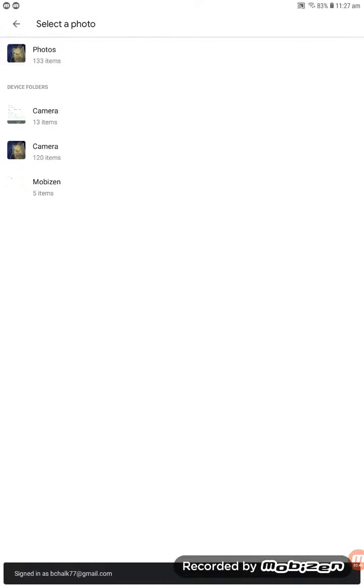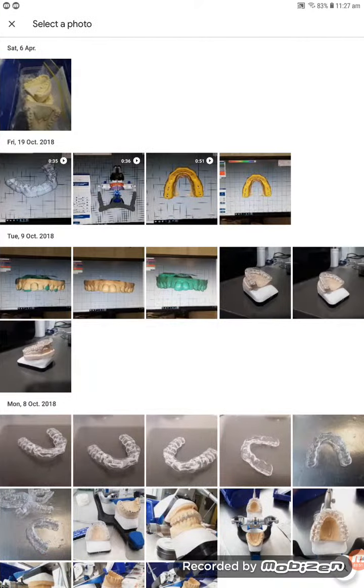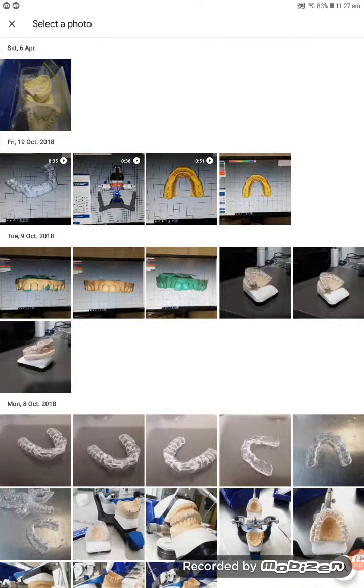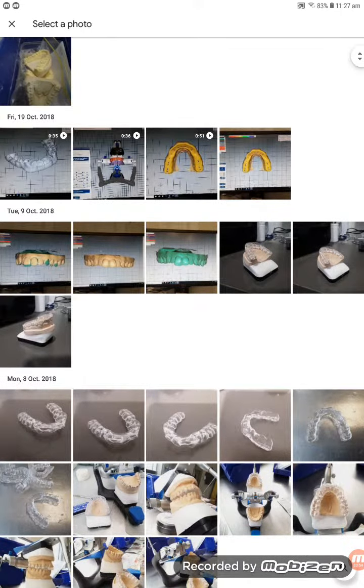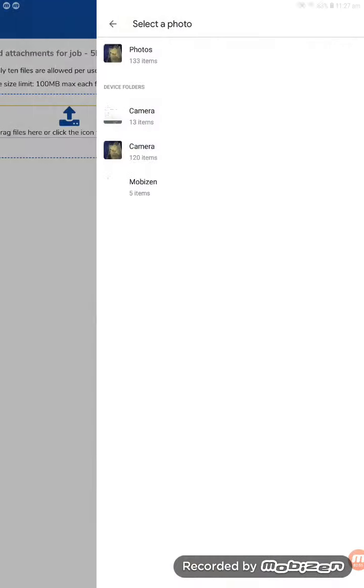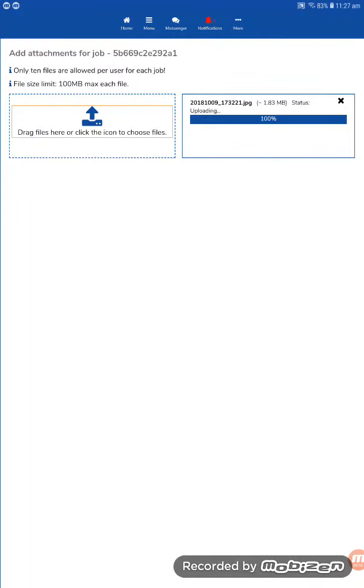go into my photos and find a relevant photo for this case. Let's say choose this one. It uploads the photo in real time, as you can see.